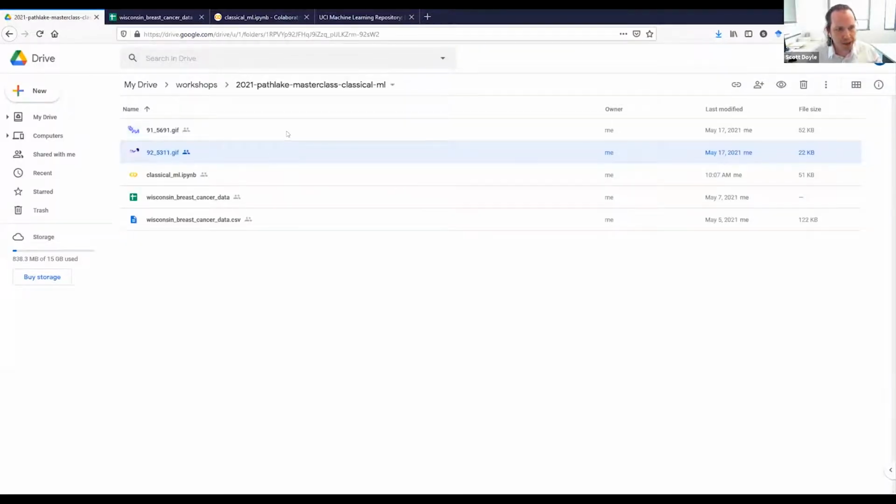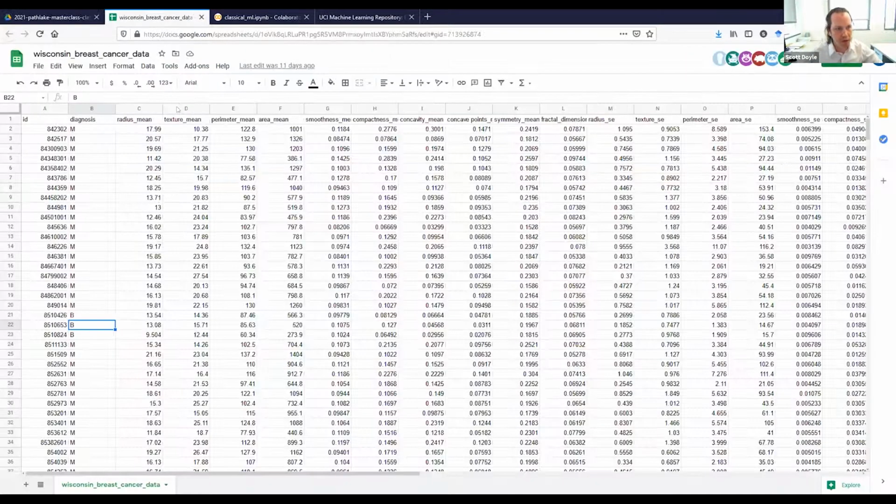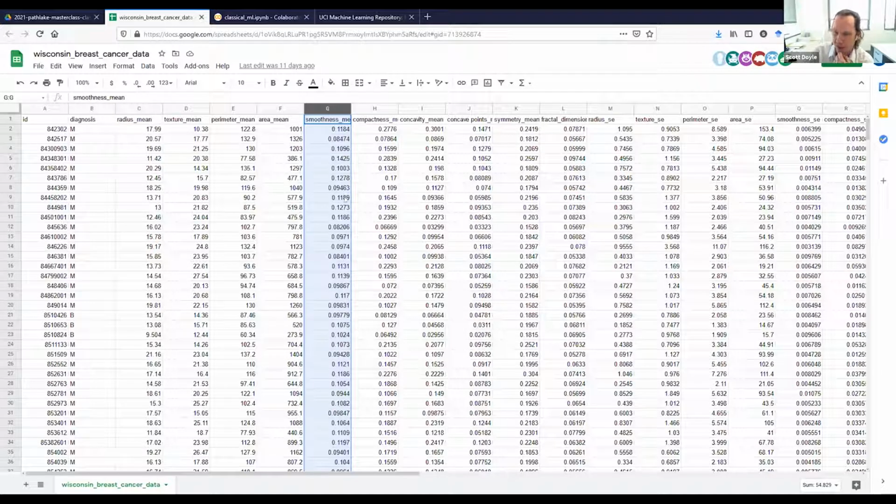And as I said at the beginning, when you're setting up your project, you want to specify: do we know, or can we justify in the literature, that these particular features are capable of identifying benign versus malignant tumors? Are these the kinds of things that a pathologist would look for in a microscopy image to designate whether a patient was benign or malignant? And then we would use that as a justification for extracting these features.